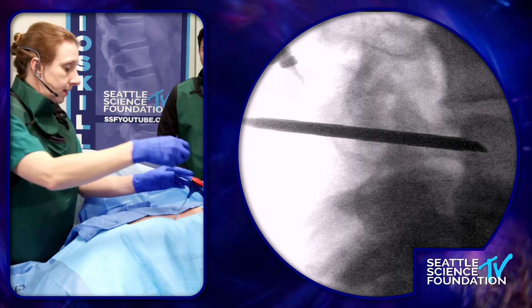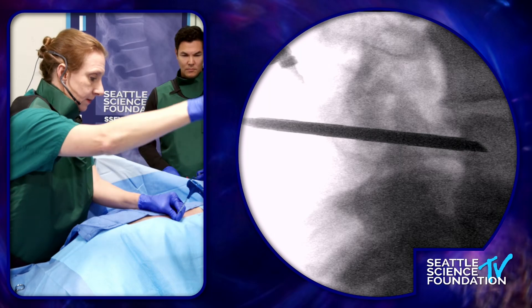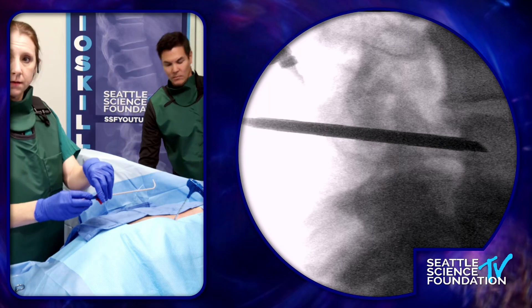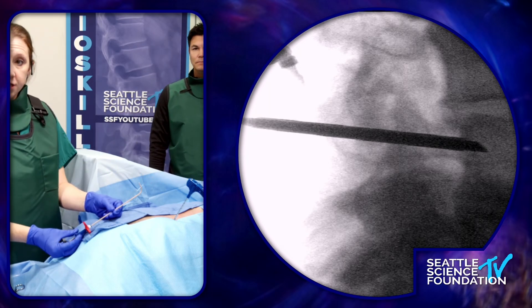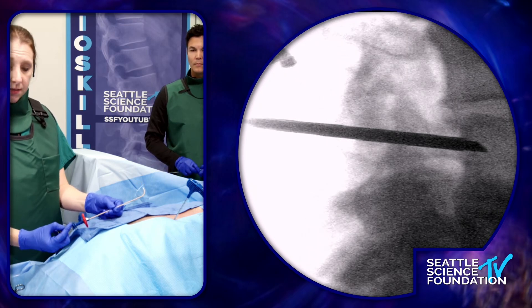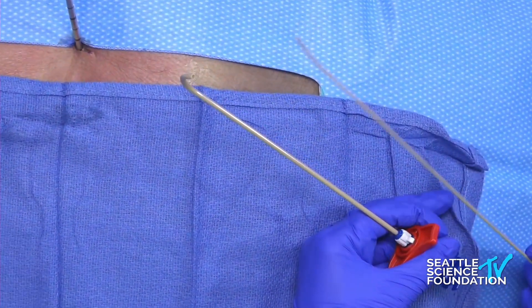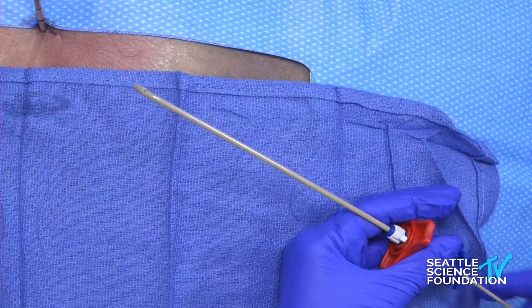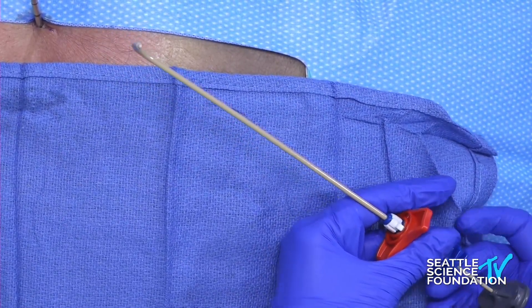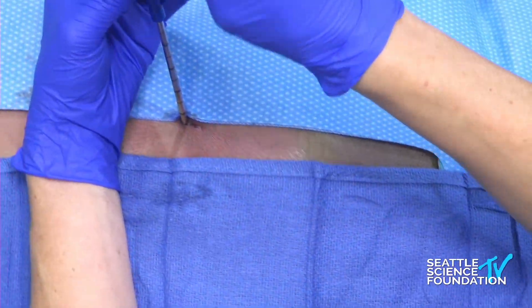That looks like it could be it right there. I'm going to take out this beveled stylet, and my assistant is passing to me the introducer sheath. This introducer sheath has preloaded in it the straight tip stylet. You could also preload the J-tip stylet, but that's pretty rigid and can be hard to advance through very easily. So many times we use the straight tip to begin.